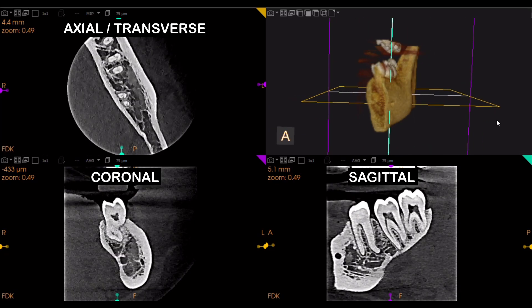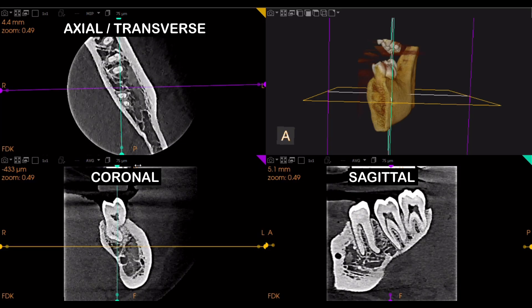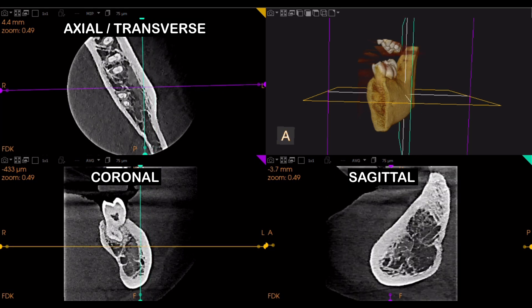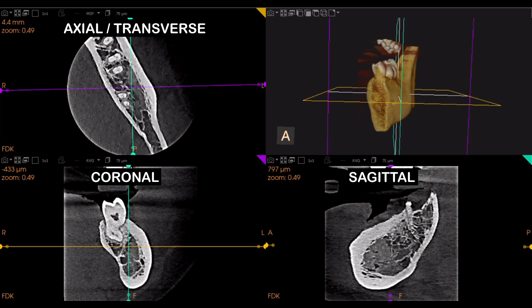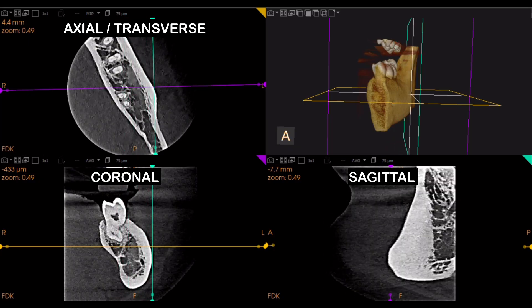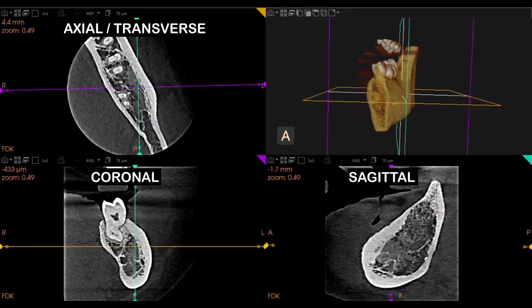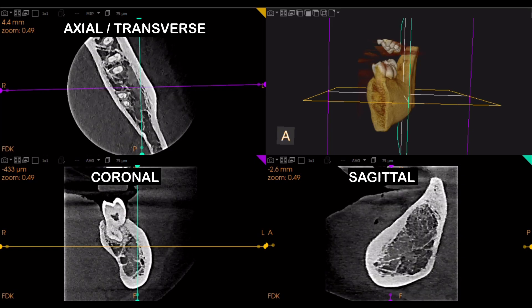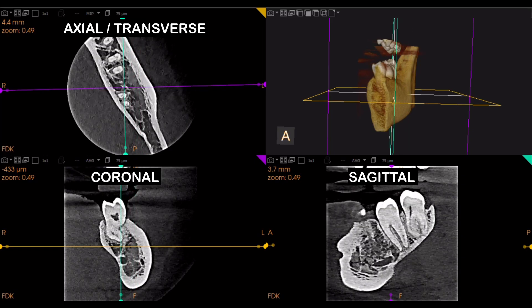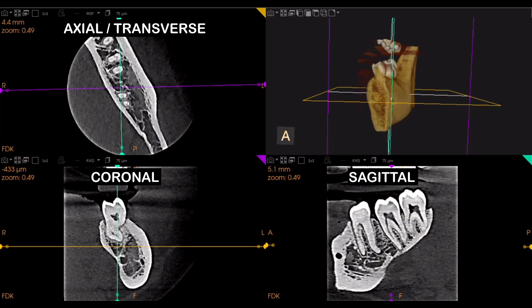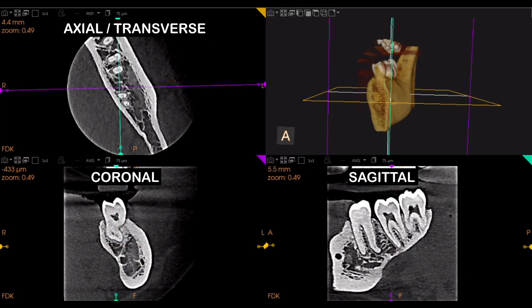The third wireframe is the green one, which divides the structure into right and left, or the medial and lateral part. The internal anatomy visible at that cut is the sagittal section. As we move the green wireframe from buccal to lingual, or from lateral to medial, you can see the structures at that particular point. You can see the buccal bone, and as we go medially, the inferior alveolar nerve running through becomes visible. Going more medially, you can see the anatomy of the tooth and the mental foramen as well.